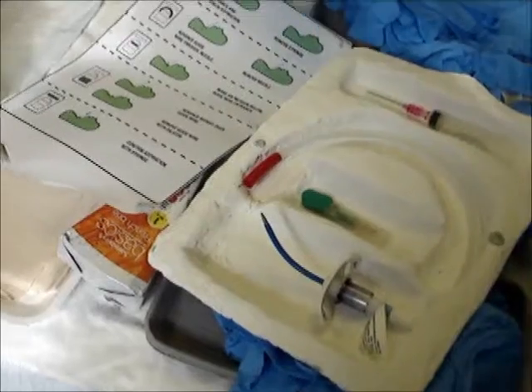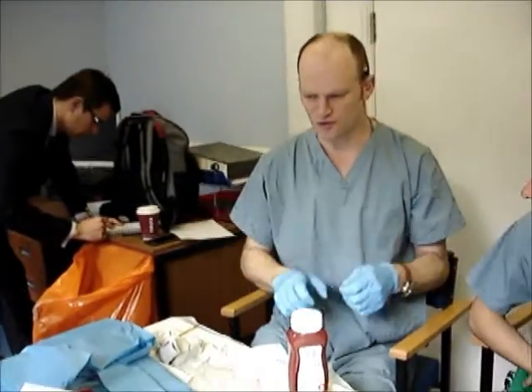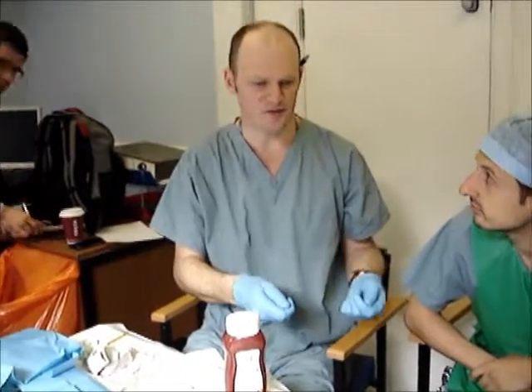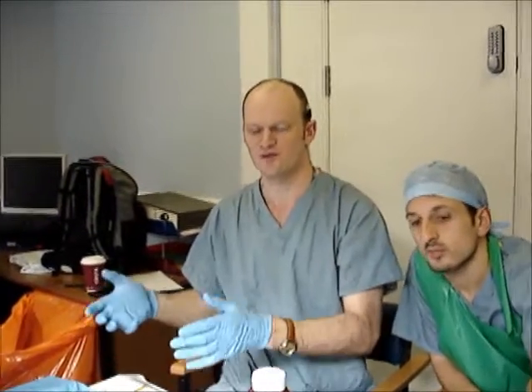And if you could see one, because you've got to remember that most times this is going to be used, it's not actually going to be used, it's going to be presented to somebody, a registrar or another consultant, saying, have you seen this kit, this is how you use it, and no one's going to open it because they don't want to ruin it. So if you can have it in such a way that it's numbered or there's instructions and it's all readable without taking it to pieces, then that's fantastic.